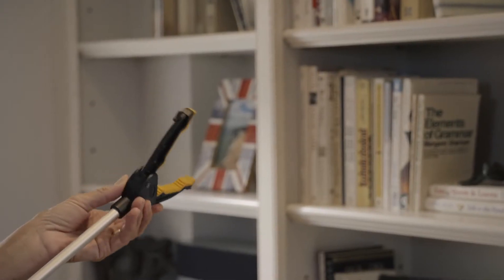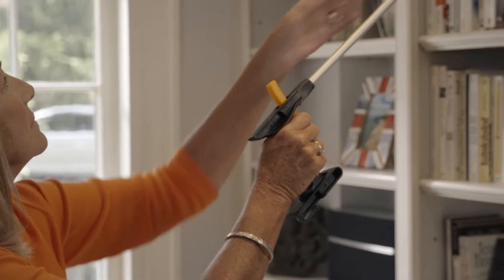The claw can grasp all sorts of things and Mom likes that it rotates 360 degrees. If she wants to pick up something that's very heavy, she can easily open it with two hands.